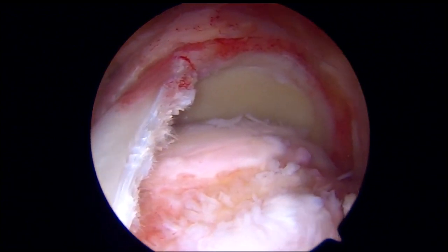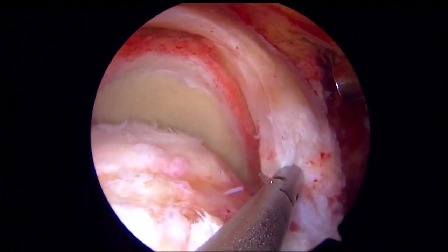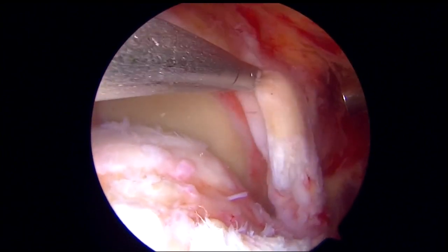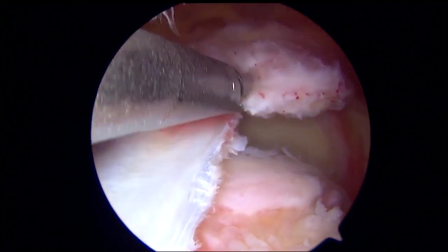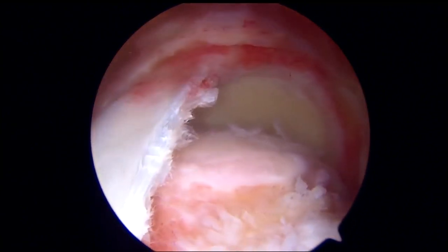Various examples of techniques to lateralize massive retracted rotator cuff tears are shown. In this first example, left shoulder in the beach chair position, we can see a very retracted rotator cuff tendon tear that's immobile and not lateralizable back to the anatomic medial margin of the footprint.